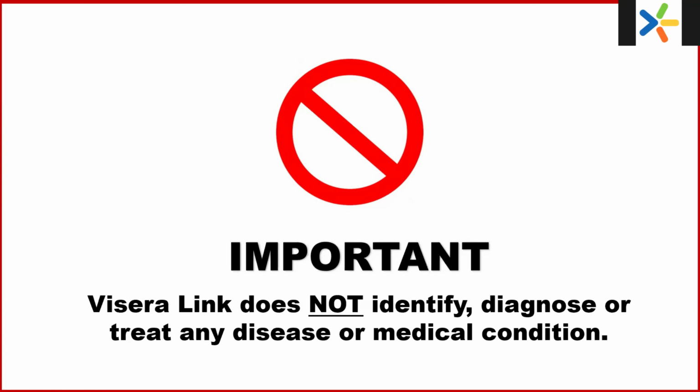Visera Link does not identify, diagnose, or treat any disease or medical condition. It's very important to remember this because when you run a scan on somebody, it's not diagnosing in the sense that it's not saying you have this disease or you have that disease or anything along those lines. It's also not looking for what's wrong with you. And if you watch the first webinar, you already know all of this, but just in case somebody skipped that one, I just want to make sure that's clear.